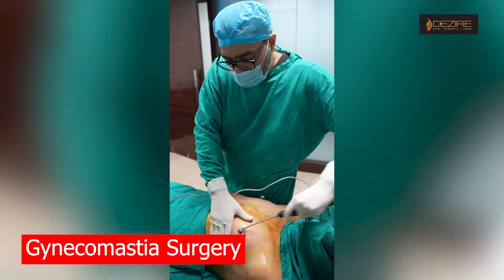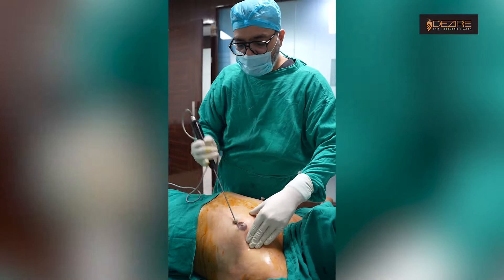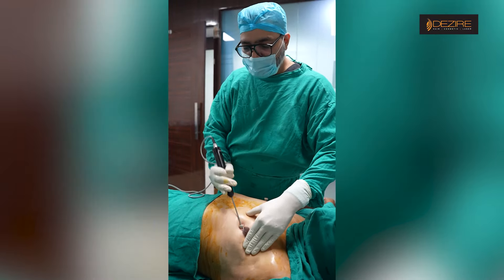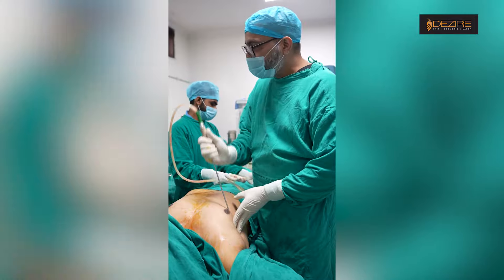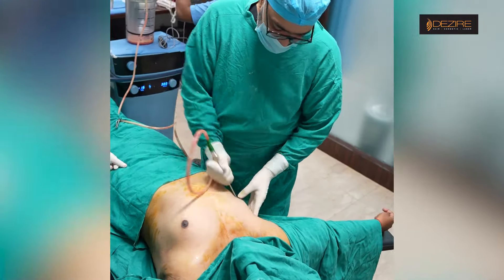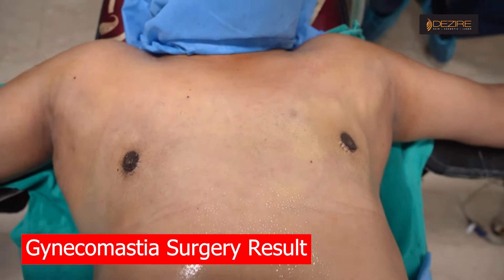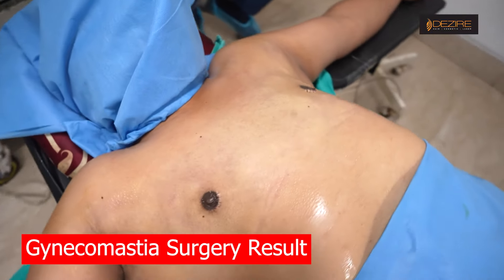We will proceed with the procedure. We will be better on that side. We will take about 2 to 3 minutes for each step and then come back. We will take 2 minutes total for the procedure.